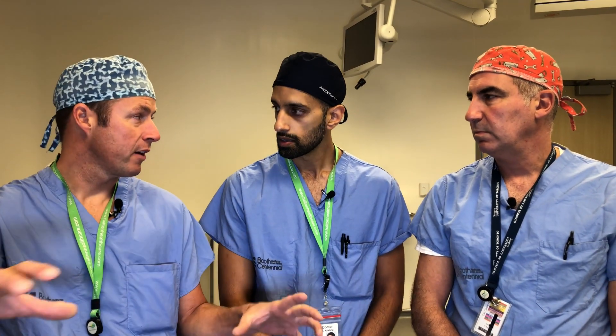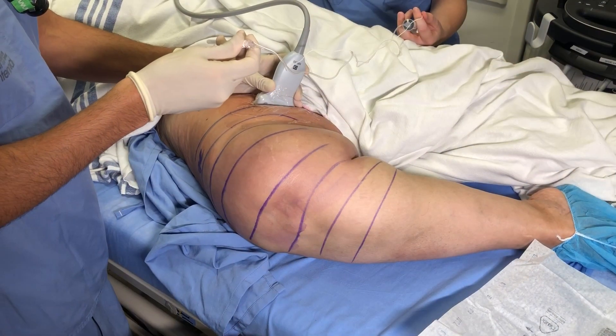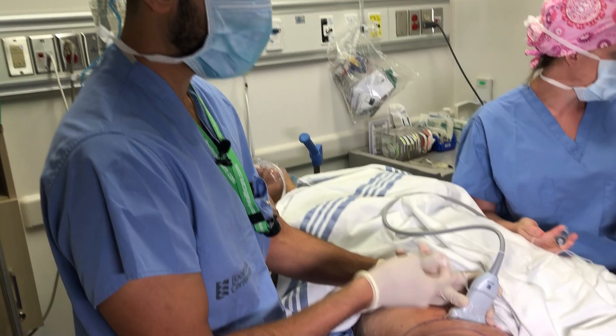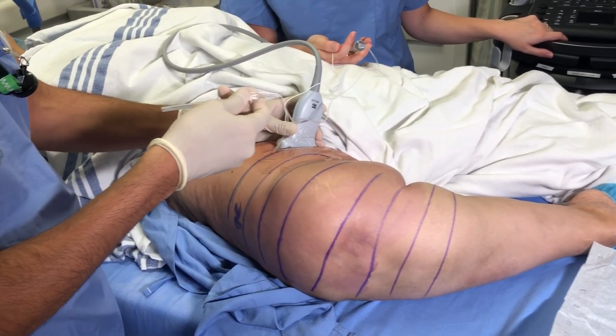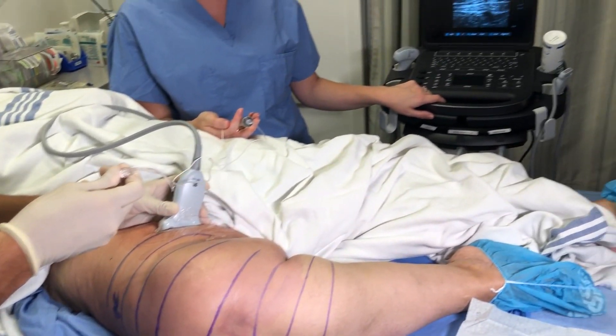So you're just kind of bathing that nerve in freezing, and then it lasts for a while. Would you mind if we watched you do it? Absolutely. Let's go check out an adductor canal block. Here we're going to apply some freezing medicine to the thigh area of the leg, which causes numbness to the front part of the knee — another form of pain relief after total knee replacement.